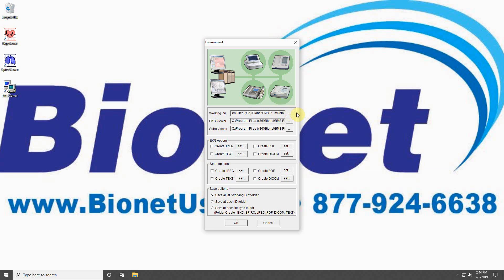This ensures that the recorded data from your machines is going where you want it to go. The fields below this are used to define where the program files for your EKG viewer and Spiro viewer are located.